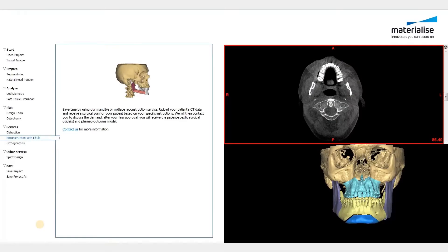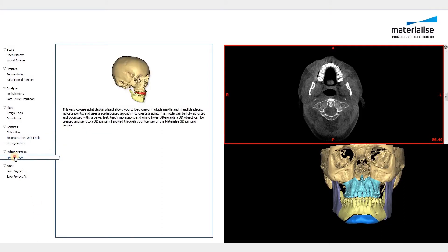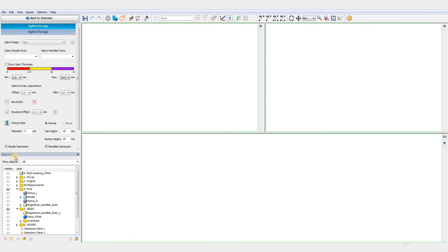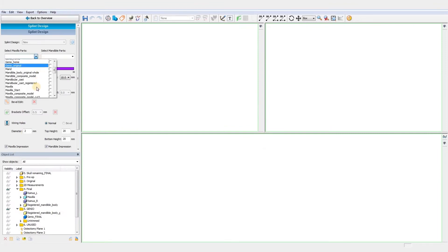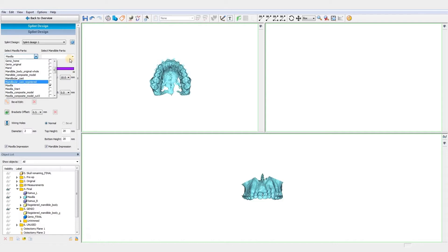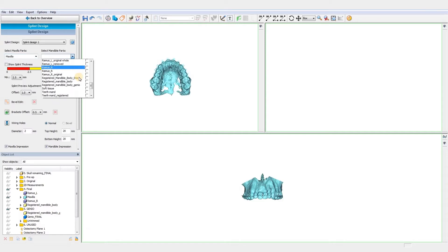Welcome to this ProPlan video. In this video, we will show the 5 steps to follow when designing splints for your CMF surgeries. Once you have performed your orthognathic planning, as also shown in a dedicated video to this topic on our website, you'll have all the required input to design your splints.